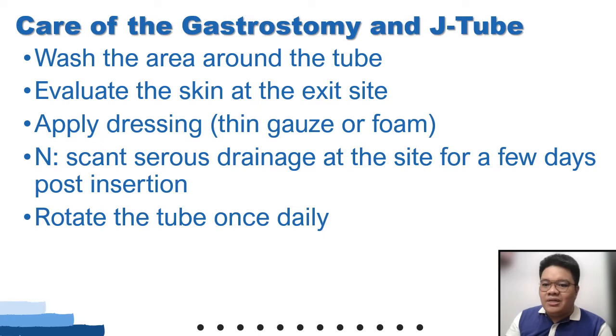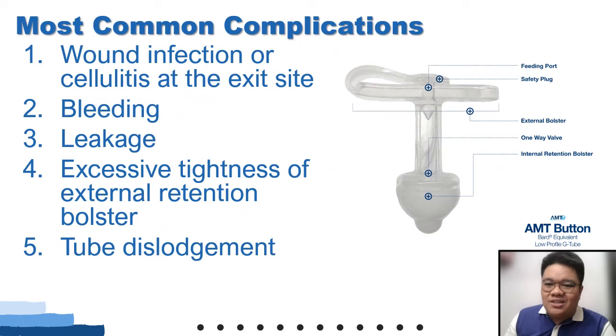Okay, class, your buried bumper syndrome is because of excessive traction of the G tube. Okay, don't think too much about that for you to understand what that is. Okay, this is class what happens in your buried bumper syndrome. If this side of the tube is buried deeply on the skin of the patient, your patient would have the buried bumper syndrome. That's why it's advised to rotate that site from time to time.